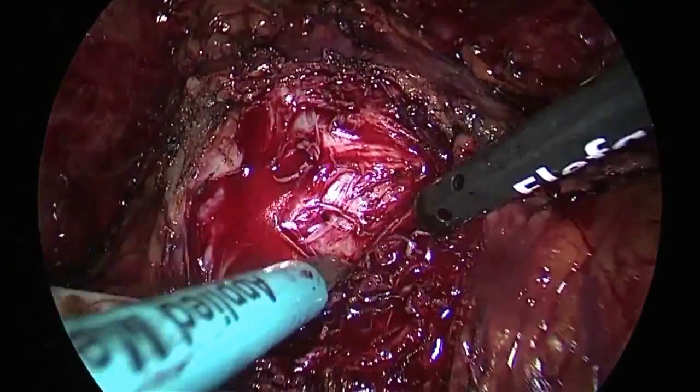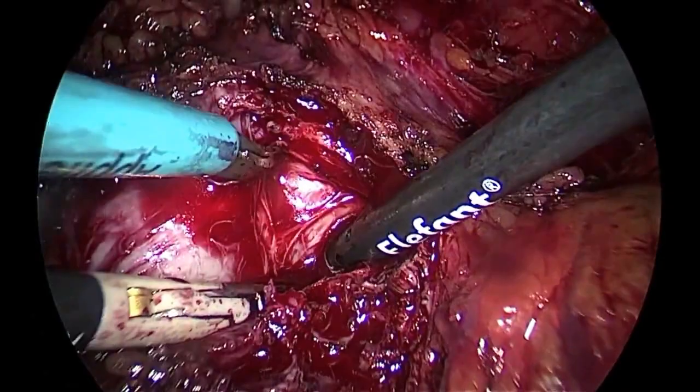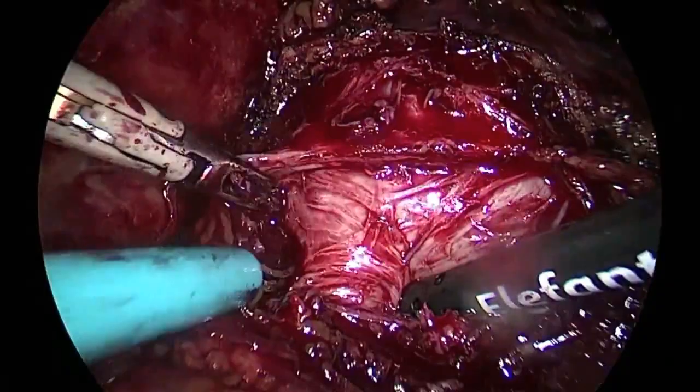Can you clean, please? As you can see, I try to gain step by step the adenoma slowly, because we have a different dissection plane, and so I try to find the best one, okay?